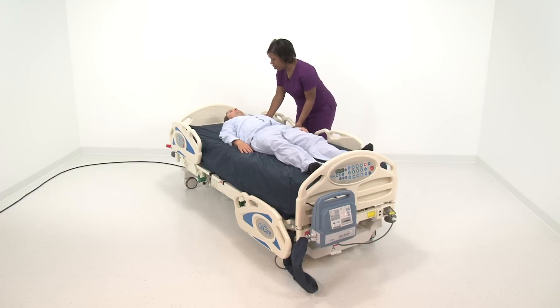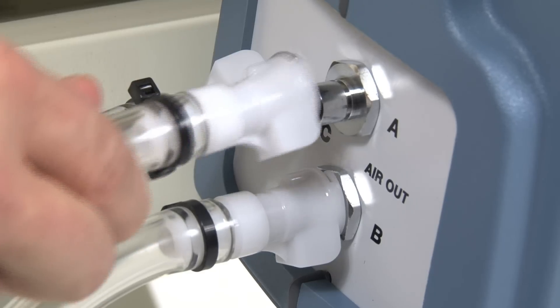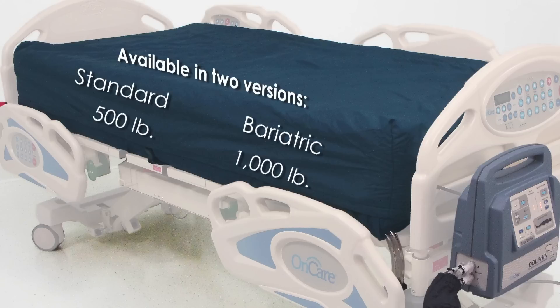Caregivers appreciate that the Dolphin not only provides state-of-the-art therapy, but is very easy to set up and even easier to operate. The Dolphin is available in both standard and bariatric sizes. The standard mattress has a 500-pound weight capacity and the bariatric mattress supports up to 1,000 pounds.